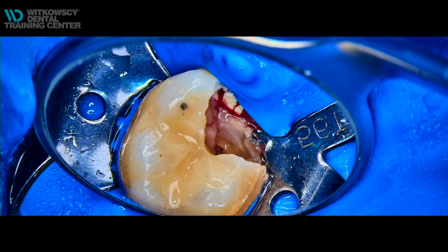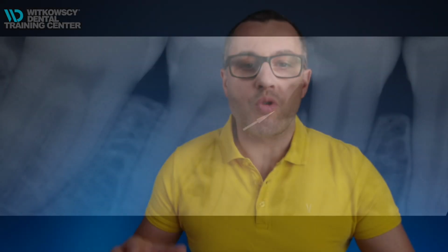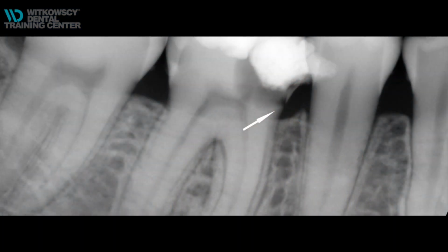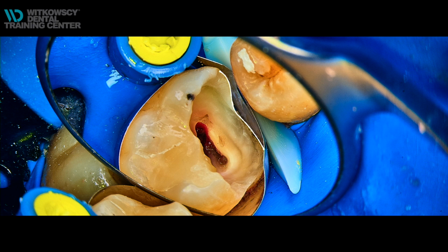I removed the temporary restoration and tried to clean the tooth. When we focus on the X-ray, the problem that we can encounter is that initially I had to do the deep margin elevation procedure. The cavity was deep, so the problem was to prep it and then isolate it properly in order to get the proper emergence profile. And as you can see, it's not round. When you put the matrix, it's not round.